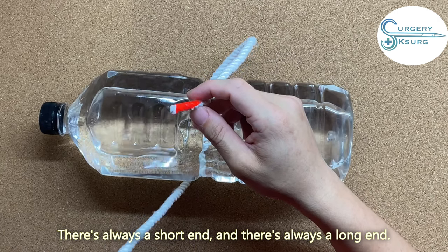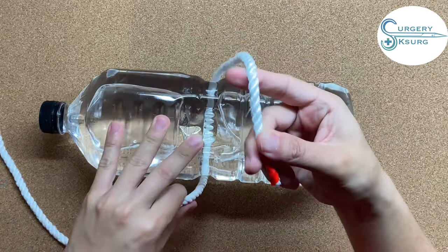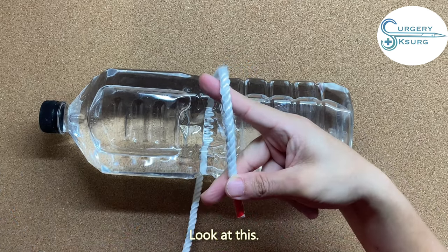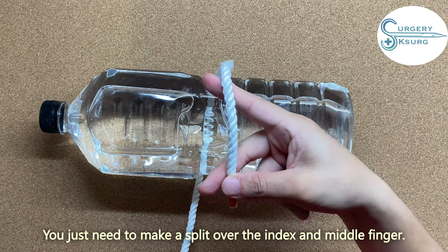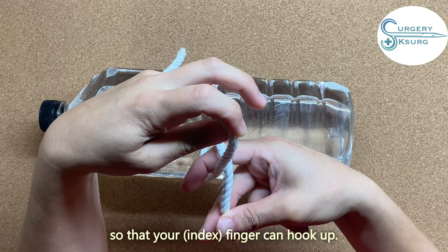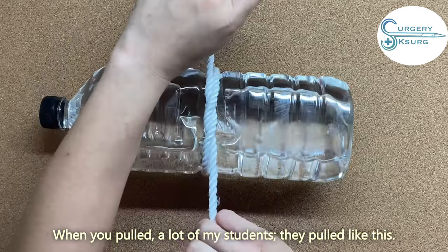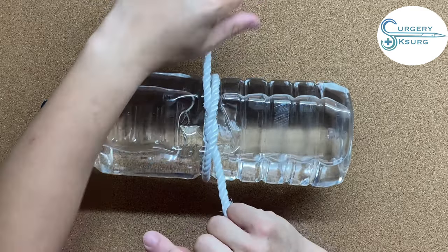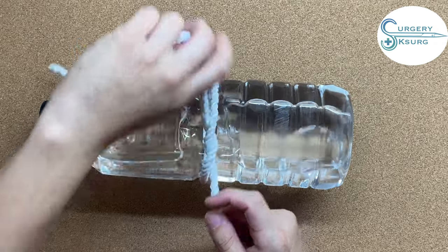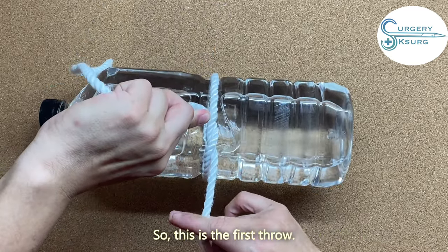There is always a short end and a long end. The long end is always where the leader is, and the short end is the end of the suture. There are many variations of doing the hand-tie — I'm showing my variation. We make a splay over the index finger and middle finger, with the thumb holding the end of the thread, coming down in the middle so the middle finger can hook up. When you pull, many students pull outward — that's not a good way. You should push your finger in rather than pull out, because if you pull out you don't know the tension over the end of the knot. This completes the first throw.